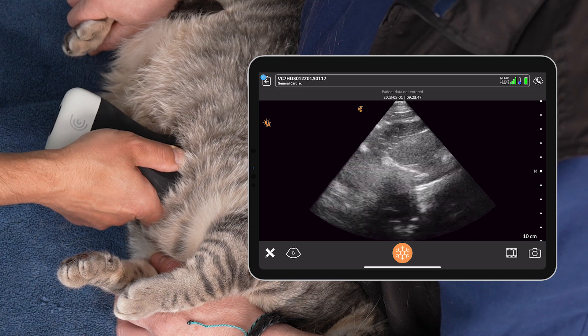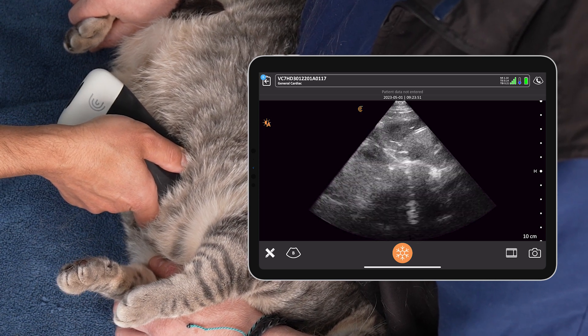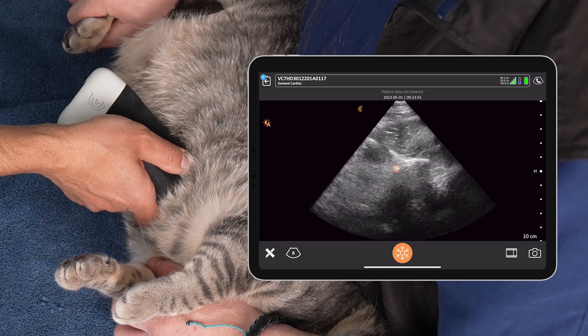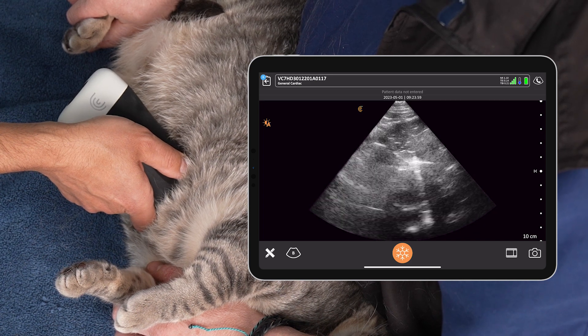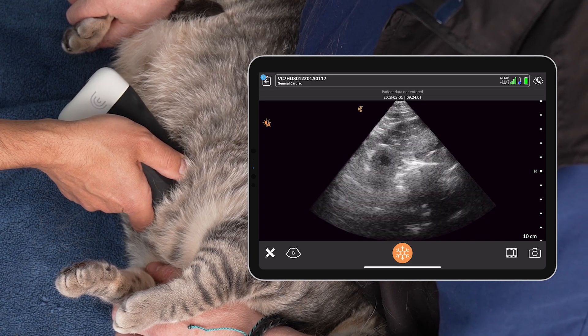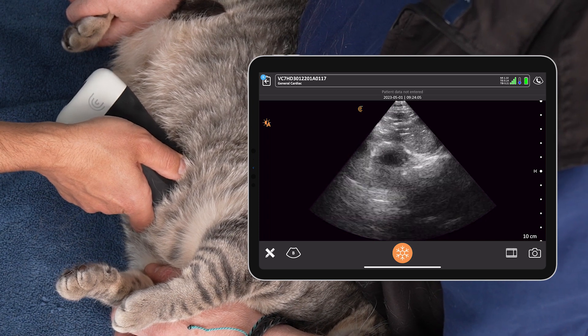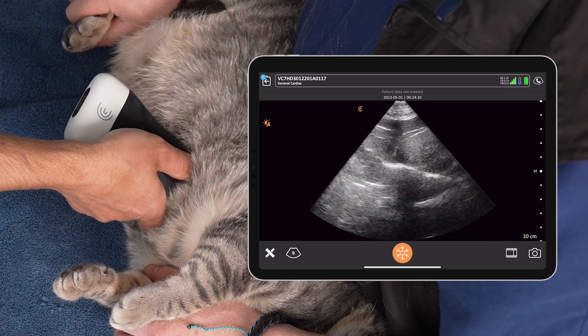What about our caudal lung surface? How does that look beyond the diaphragm? Are we seeing anything there — mirror image, B-lines, abnormalities? We see a nice mirror image on the other side of that diaphragm, which tells us we don't have any caudal lung pathology at the sub-xiphoid here. There's no lung pathology and also no pleural effusion. That mirror image tells us we have air in this plane beyond the diaphragm, so we can successfully rule out pleural effusion at this site.